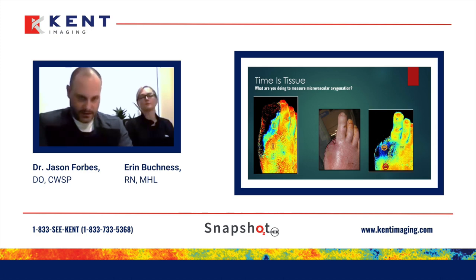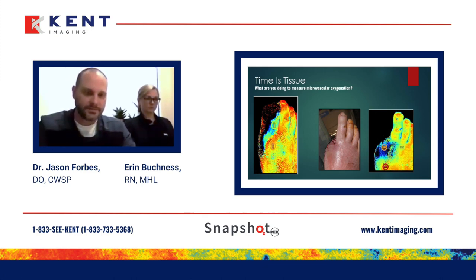So to get to the question, how early can you see significant changes with the camera versus seeing it in your clinic? That is such a nuanced question because it's a little bit different for everybody. I can only give you anecdotal evidence, because part of the limiter is that I don't see people more than once a week. If I could see them every single day, I could catch it and say, okay, that was the 24-hour difference or the 48-hour difference. I only have the 1 week to know, so my answer is going to be 1 week, because I'm going to see it right after surgery.